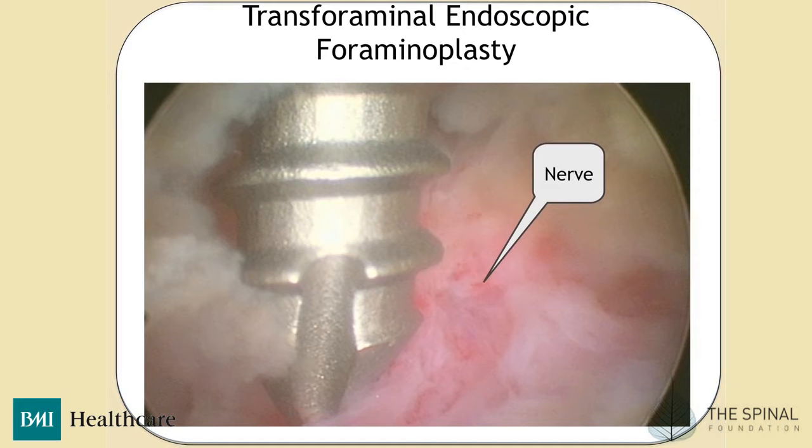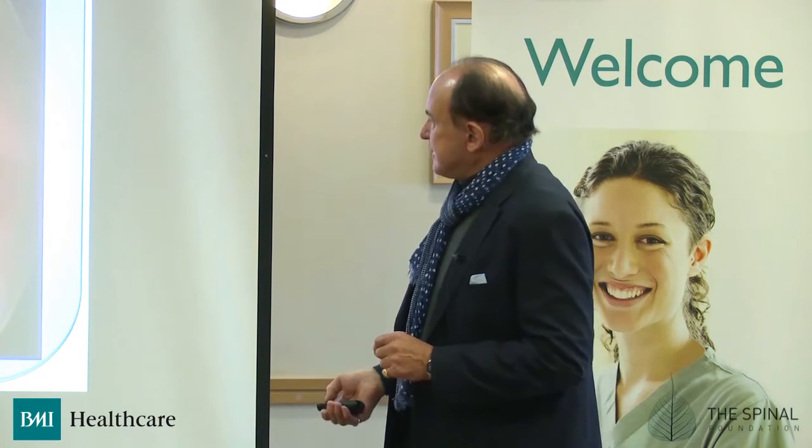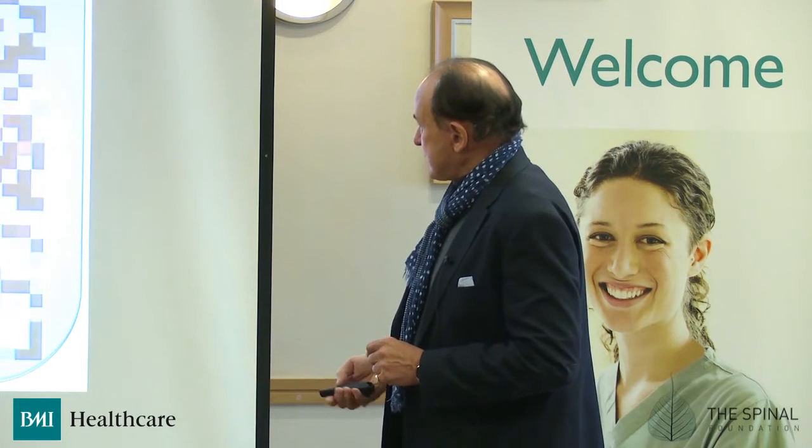Sometimes we bump into things that oughtn't to be there. And this is the nerve sitting here. This lady showed or bred Great St. Bernard dogs, and you can guess that she was 4'8". So the dogs were taller than she was. So we removed that. We mobilized the nerve first, removed that a few days later, and she's still showing dogs at Crufts, now without pain.